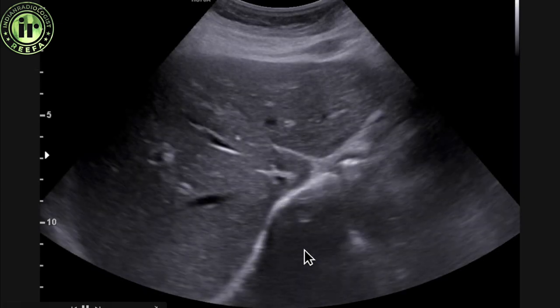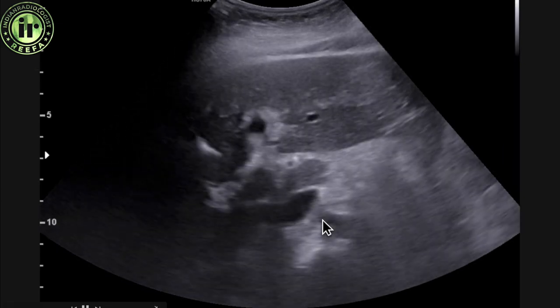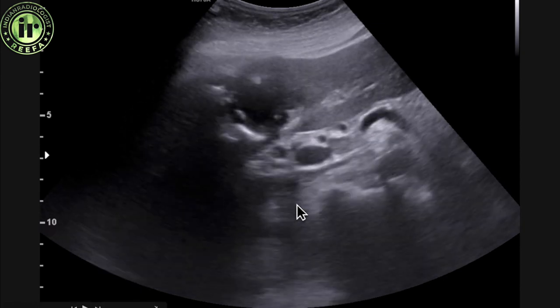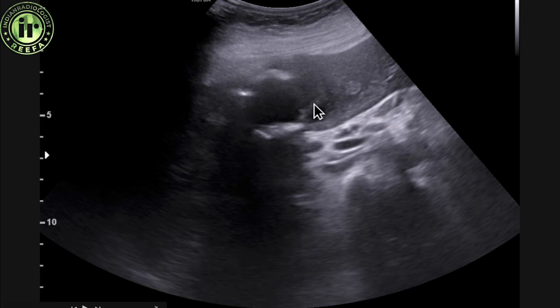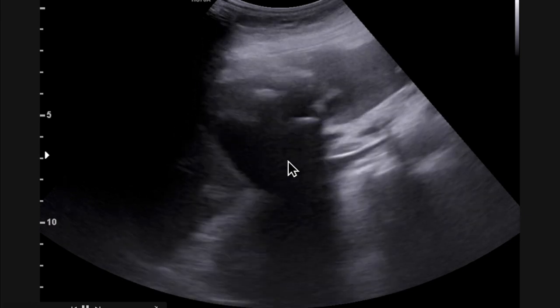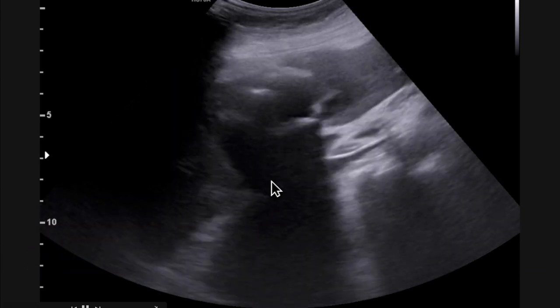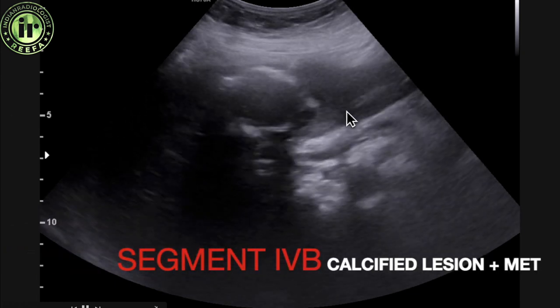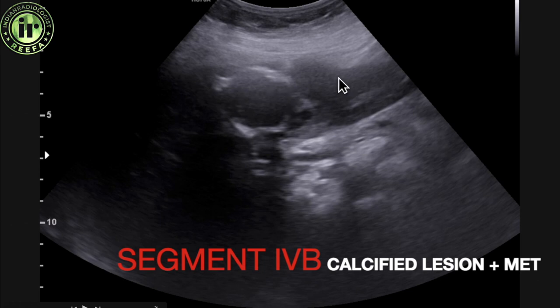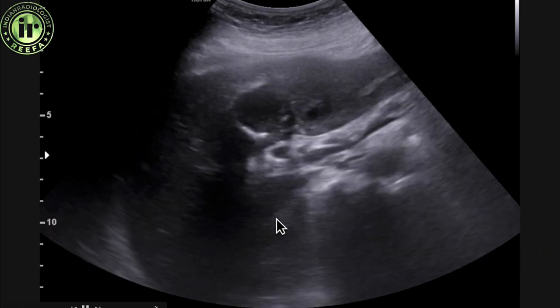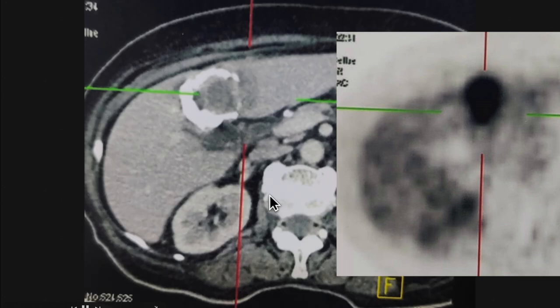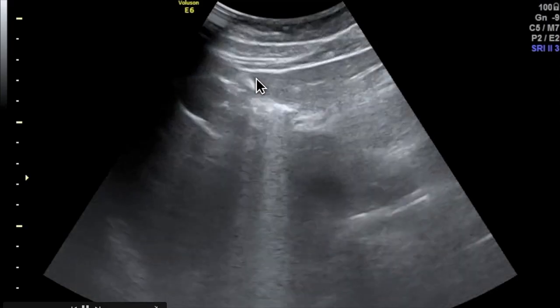Moving to the next case: a tricky case because the patient came with a calcified lesion in the liver, but PET-CT showed high metabolic activity, which was unusual. On ultrasound, we can see a calcified lesion in segment 4b, as it is to the left of the portal vein. Just next to that calcified lesion, there is another hypoechoic area. This patient had a history of CA colon — the calcified lesion was old, but a new hypoechoic area had developed, which was picked up on PET-CT and confirmed on ultrasound and in the left lobe.